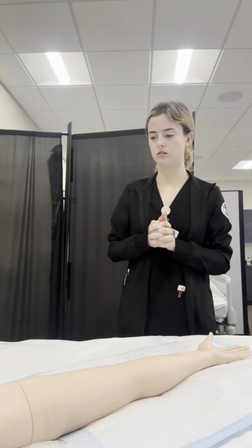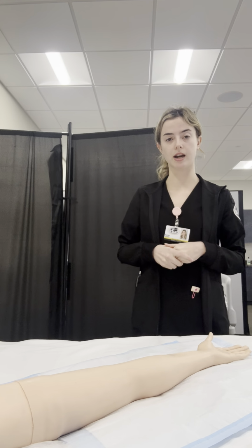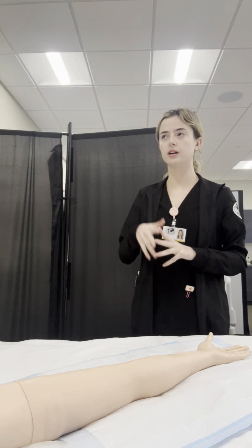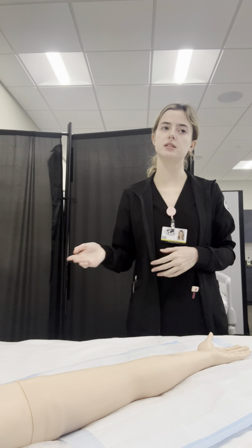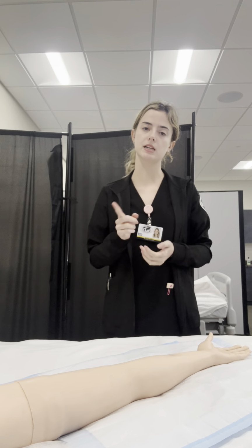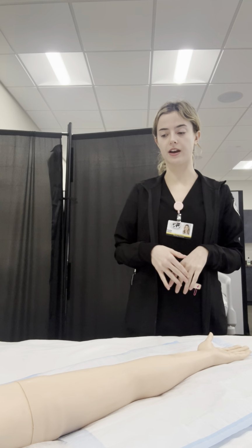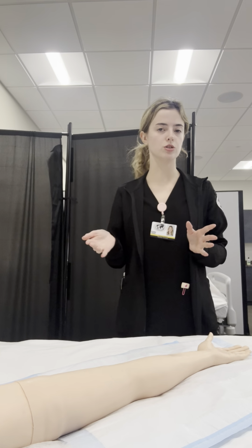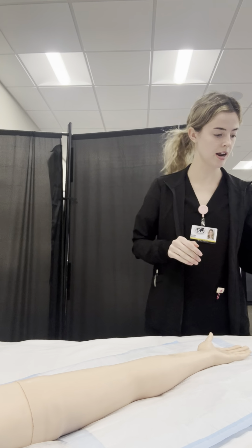All right, so now I would want the bed at an appropriate working height. So the bed is raised to an appropriate level for me, ensure adequate lighting. I would also ask about hand dominance. So if the patient is right-handed, I would maybe want to assess first the left hand and arm to see if I could access a vein there so that they could still use their dominant hand freely. And then I also want to avoid any surgical sites too. Okay, so now I am ready.